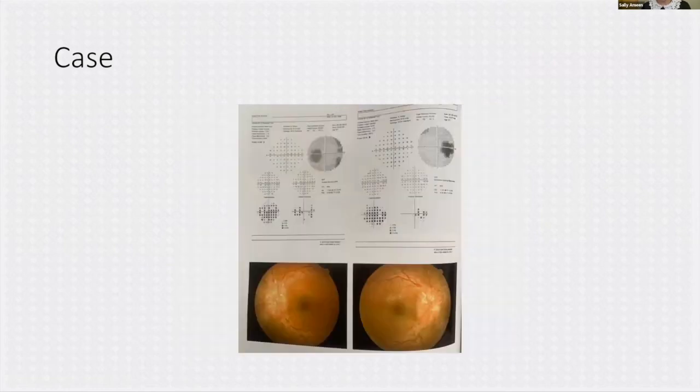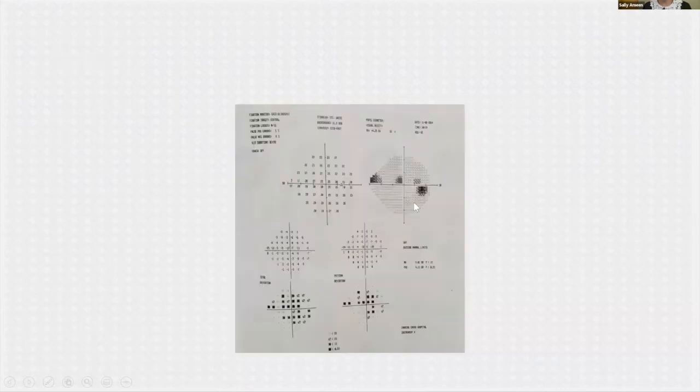And actually, other causes of visual field changes. So obviously it's not all glaucoma. You see this is a patient with bilateral swollen discs. And the main thing that you see on the visual field is essentially the enlarged blind spot. What's interesting about this, again, if you look at the mean deviation versus the pattern deviation, there's a global reduction in the whole visual field. But when you look at the pattern deviation, the main focal area where there is extensive loss is at the blind spot, and the rest of the chart is actually absolutely fine.